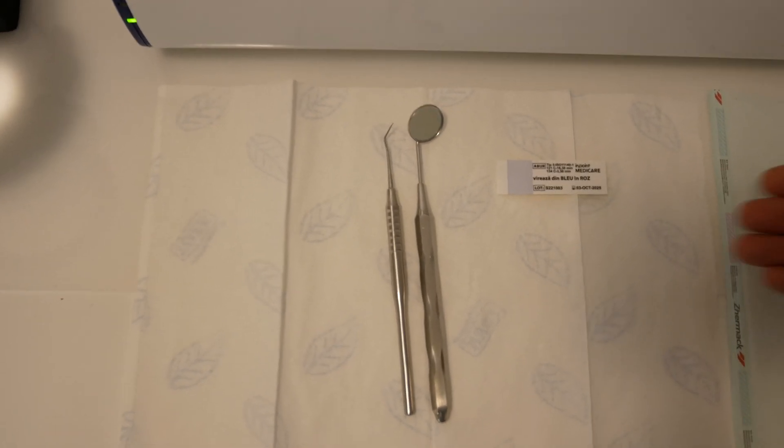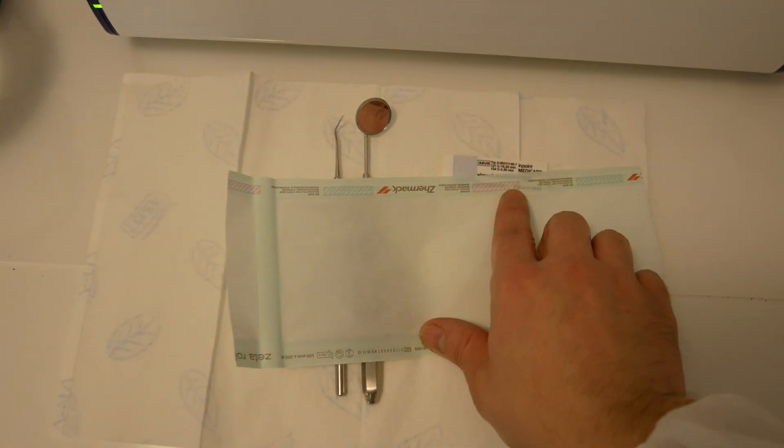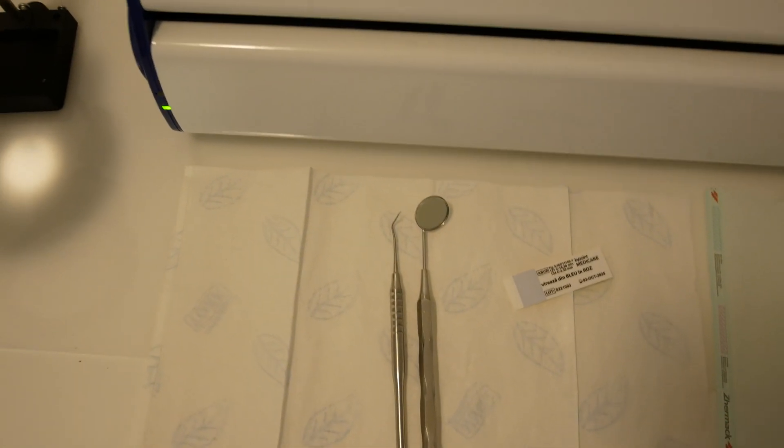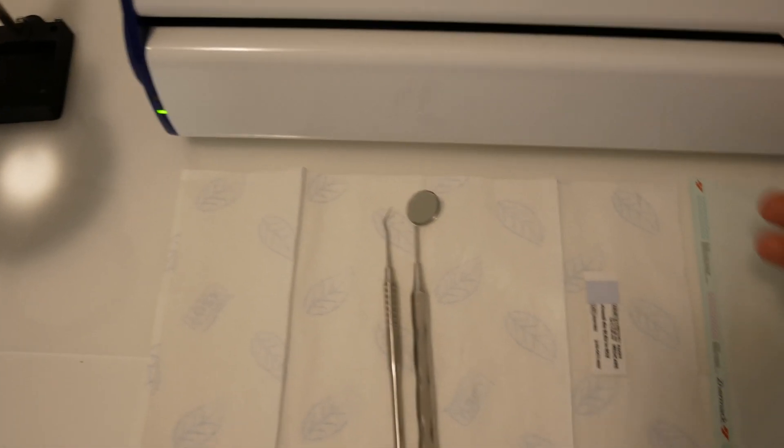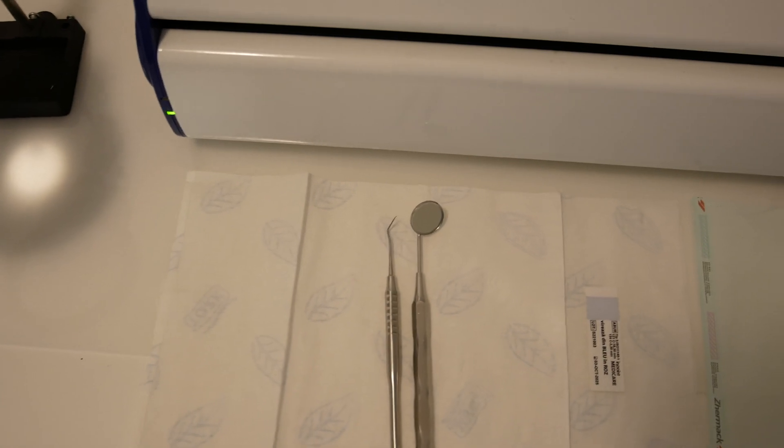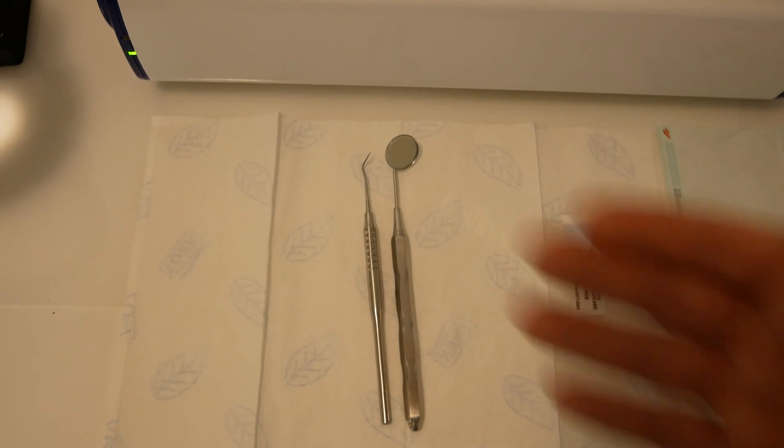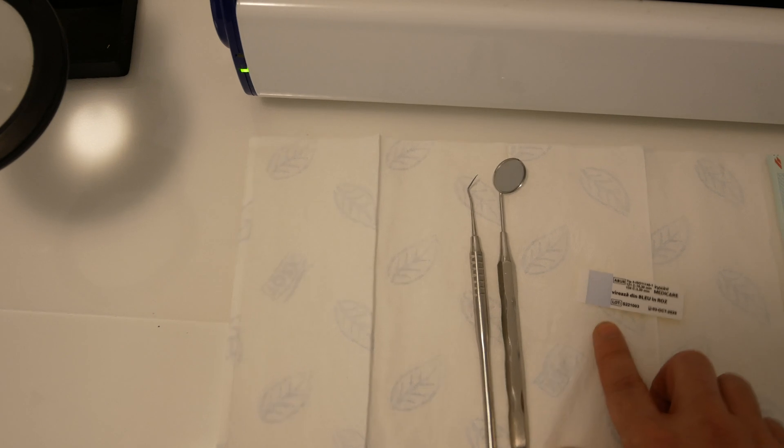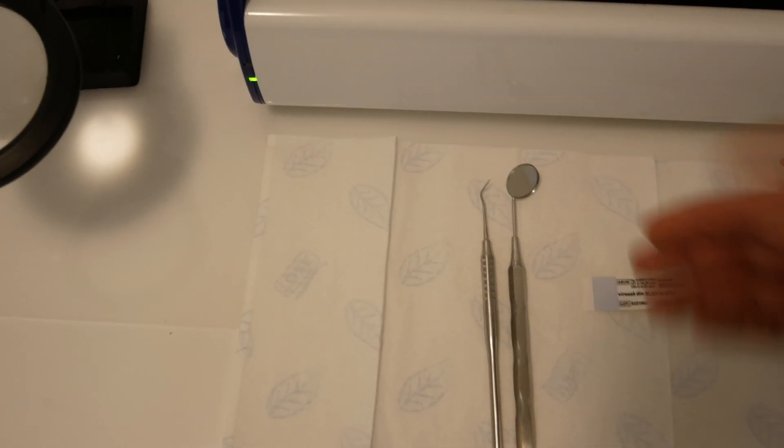The bag also has some indicators, but they're class 1. These indicators only show you that the bag has been in an autoclave and the outside of the bag has been sterilized. But it doesn't say anything about the inside of the bag and the actual instruments. When this changes color, you can be sure that the inside of the bag is sterile.